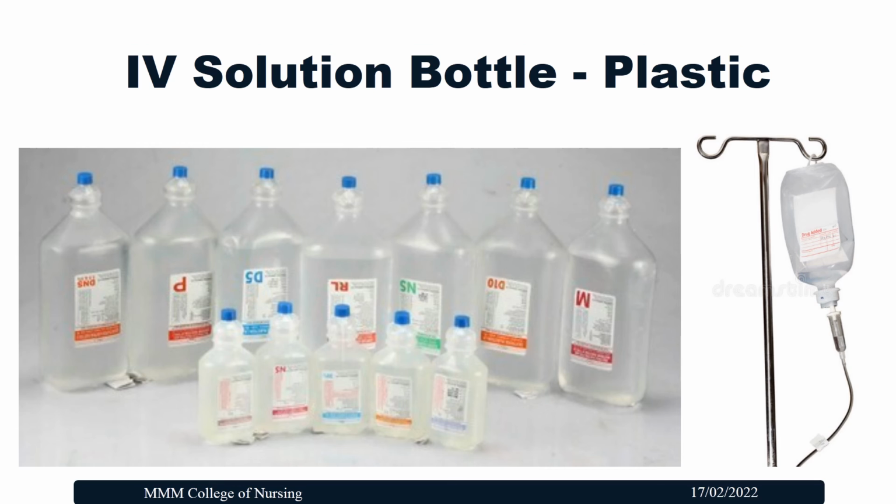The plastic IV bottles are prepared with the technology of BFS, that is blowing the container, filling the container and sealing the container. The main aim is preparing and serving the sterile medication. These containers are partially collapsible.